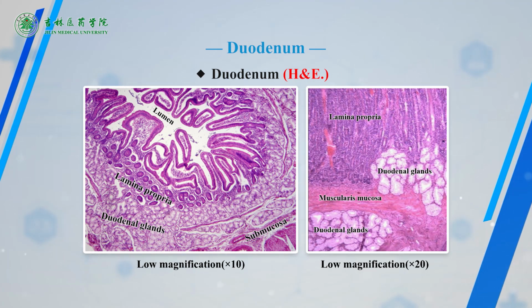The epithelium and the lamina propria protrude together into the lumen, forming a willow leaf-shaped structure named villi, the cross-section of which appears as a circular solid structure. Some smooth muscle cells are scattered in the lamina propria. The axis of these smooth muscle cells is parallel to that of the villi.